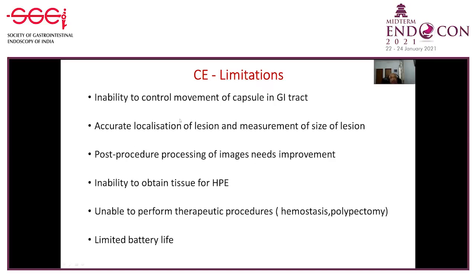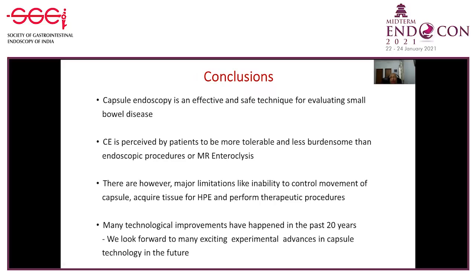So in conclusion, it is a safe technique for evaluating small bowel disease. It is perceived by patients to be more tolerable and less burdensome than endoscopic procedures or MR enteroclysis. There are, however, major limitations like inability, as I said, to control movement of the capsule, acquire tissue for pathology, and perform therapeutic procedures.